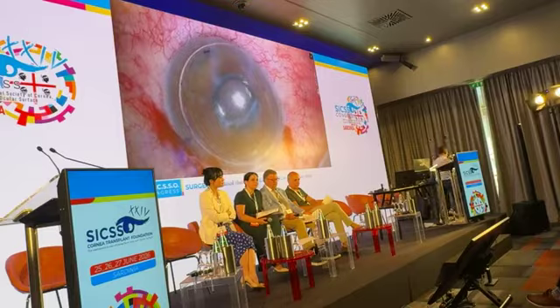Okay, so in this case, they are getting the cornea. The cornea has been pre-peeled from the Venice Eye Bank. It has also been pre-stamped. However, I discussed this with Dr. Bezek before, and he likes to make sure that the stamp on the cornea that he is going to transplant, so the Descemet membrane and endothelium, is a good stamp. So he will remark the cornea.